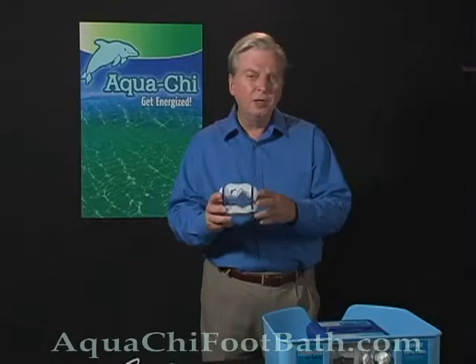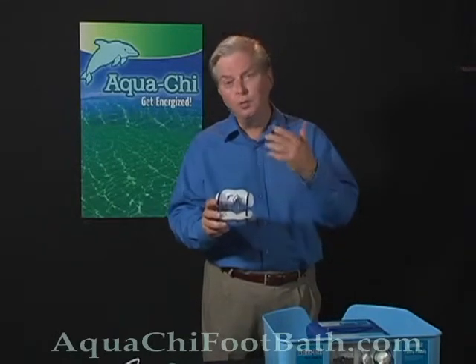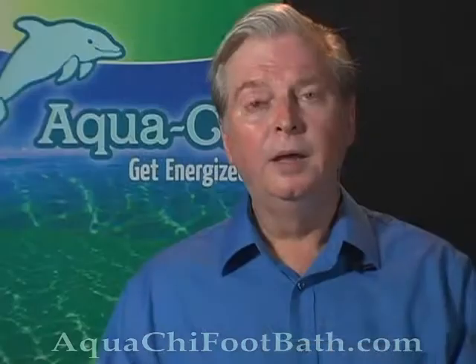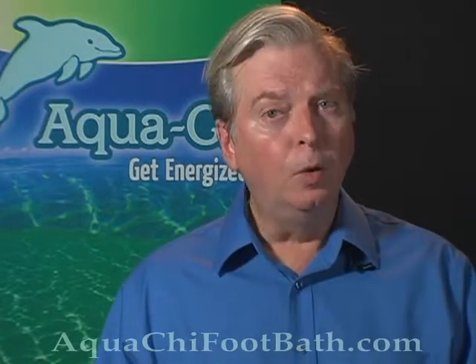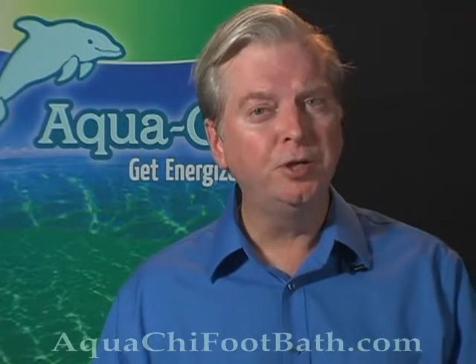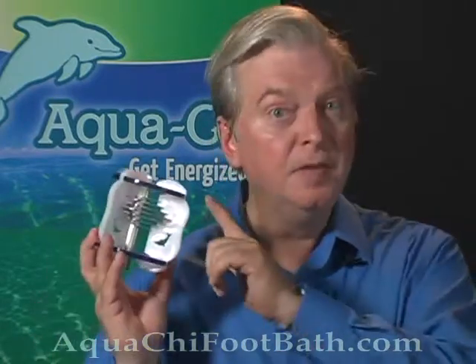Another thing to think about is if you added salt to the water, you may want to dump the water and start over, because if you put in too much salt, that could also cause the fuse to blow. Now, if it's neither of those 2 things, then again, call technical support immediately. The only other problem you might have is if you're doing a treatment and the water is not changing color, your module may need a deep cleaning, even if it looks like this one.